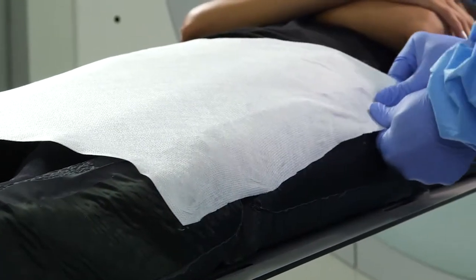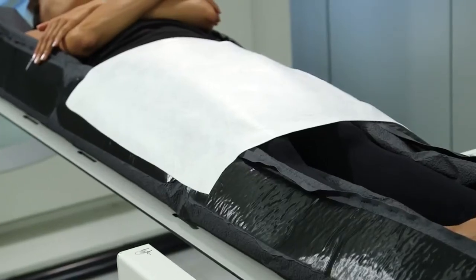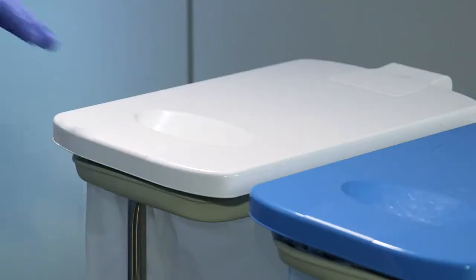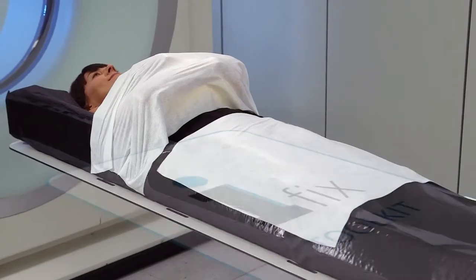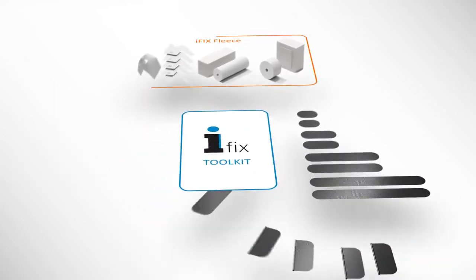It contours to the patient's anatomy like a second skin and secures them in the desired position. The fleece as a single-use component improves hygienic conditions and lowers the risk of cross-contamination. The fleece is attached to a reusable anchor product.